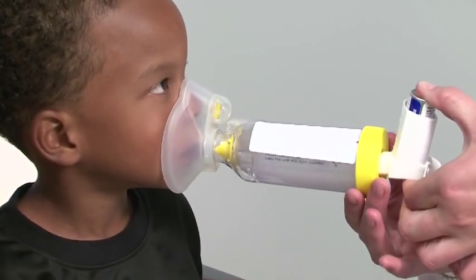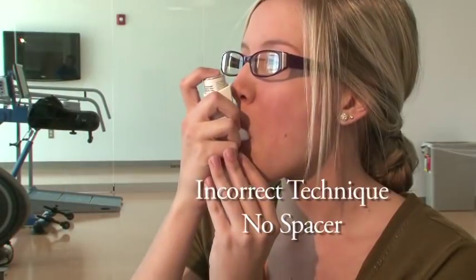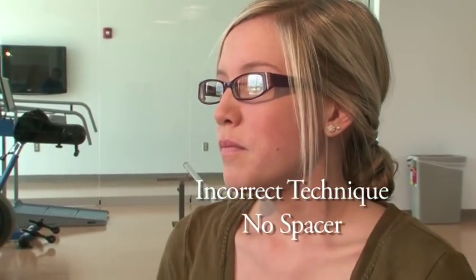It's very important to use your inhaler the correct way to make sure the medicine gets deposited in the lungs, where it works the best. Incorrect technique can leave some of the particles from the medicine on your tongue or throat, where it won't help at all.